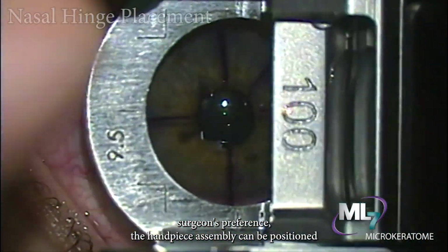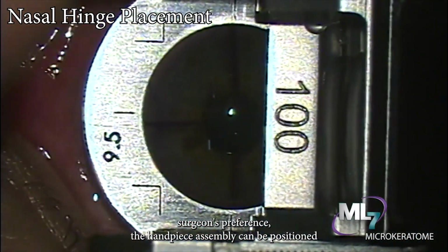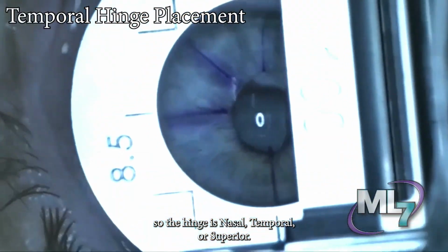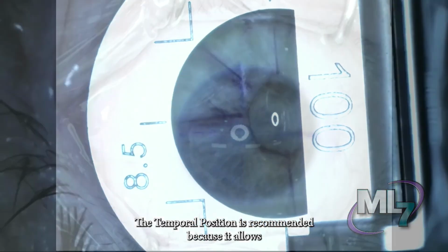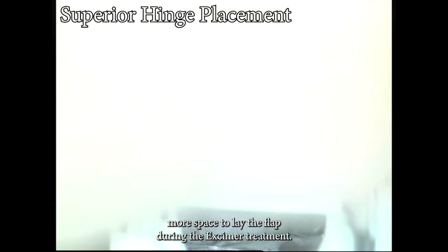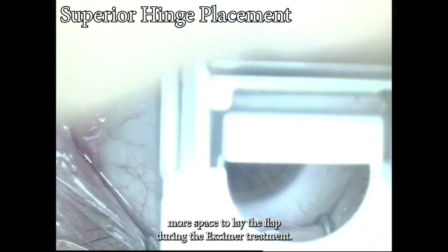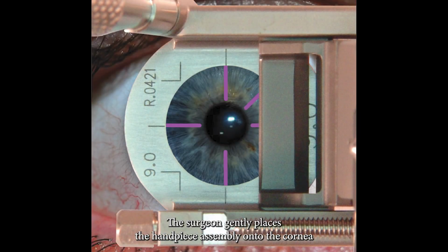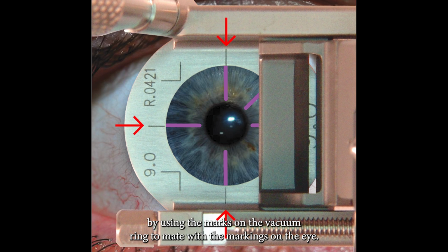Depending on the surgeon's preference, the handpiece assembly can be positioned so the hinge is nasal, temporal, or superior. The temporal position is recommended because it allows more space to lay the flap during the excimer treatment. The surgeon gently places the handpiece assembly onto the cornea by using the marks on the vacuum ring to mate with the markings on the eye.